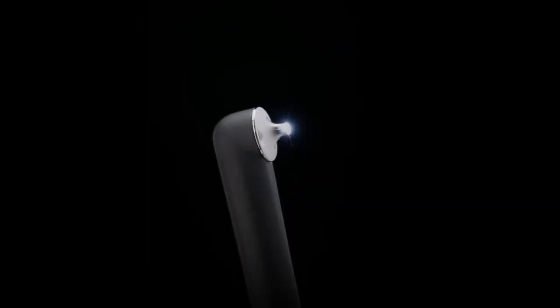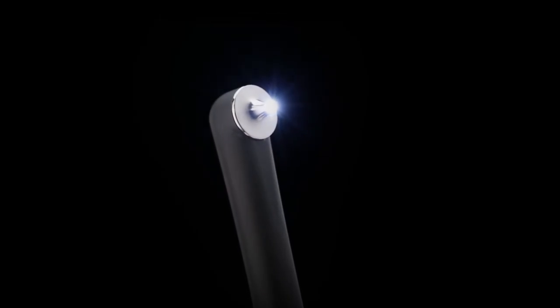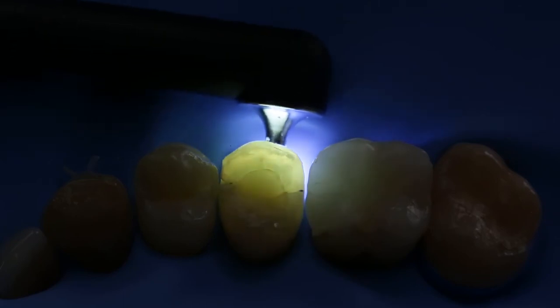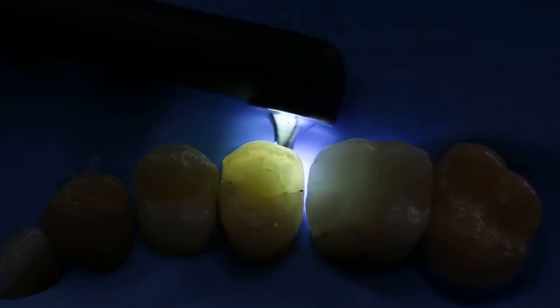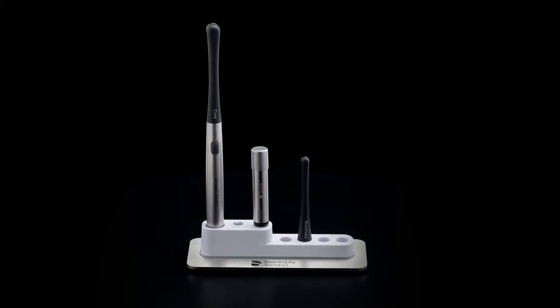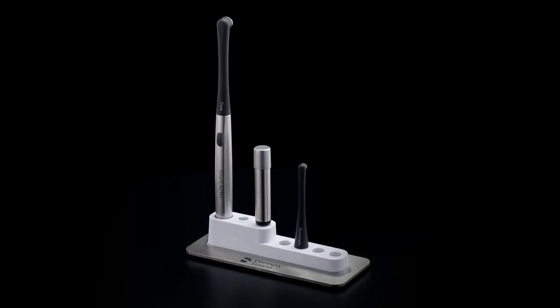For example, the specially designed trans-illumination tip helps you locate caries, crown fractures, and root canal orifices. The multifunctional charging base provides room for extra tips to meet your needs as dental technologies continue to advance.